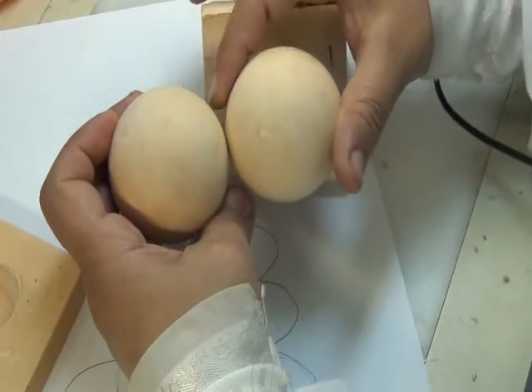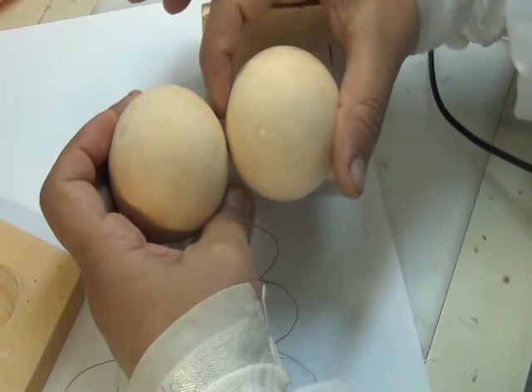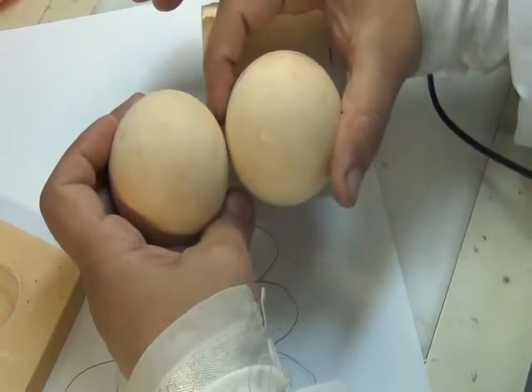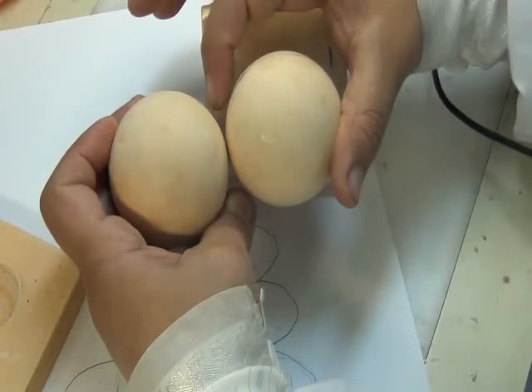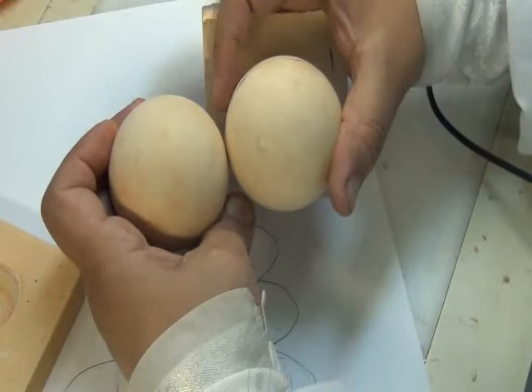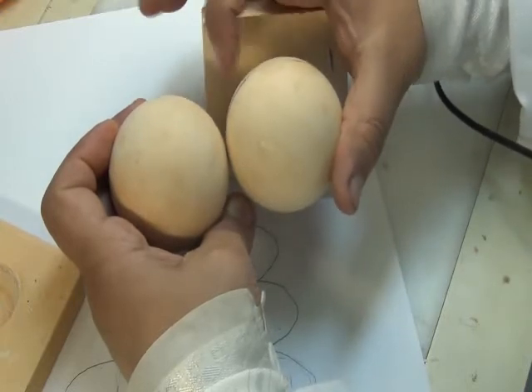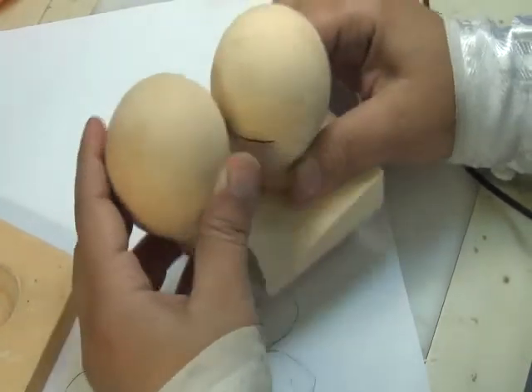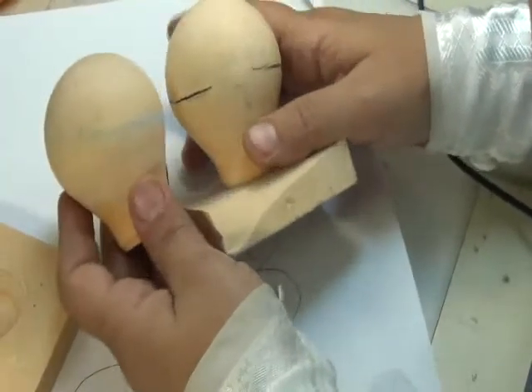This is the best location for the wire to hide, not touching the contact. The wire should not touch the contact. If you wire bend and it's touching, try at the very end to cut the last millimeter touching. It's a bit away from the contact, but inside this embrasure, the buccal embrasure. So these are what we call embrasures. Okay, let's go back to the wire. Where should the wire be?